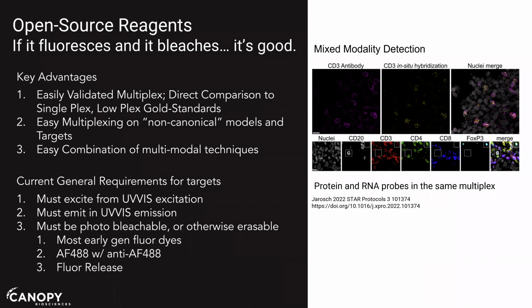So we can also take a look at things like RNAscope, or being able to use RNA signal in conjunction with IF. So, in the particular case of this mid-plex of 15 to 20, what this is really useful for is in combining it with looking at markers or moieties that don't necessarily have a good antibody, or alternatively, don't have a good localization. Consider basically any cytokine.